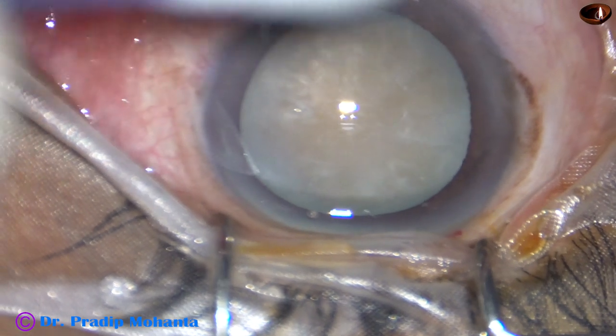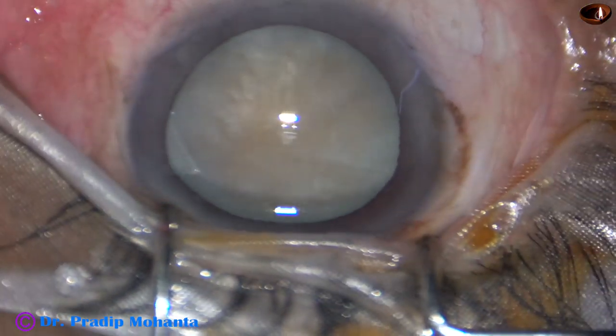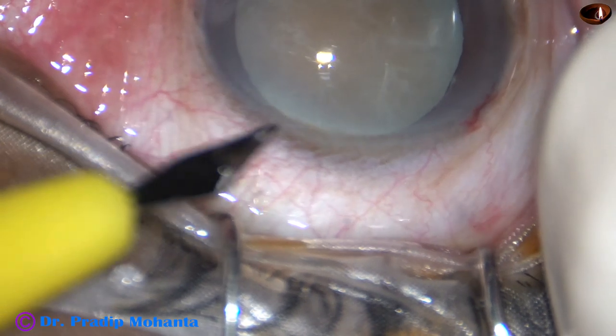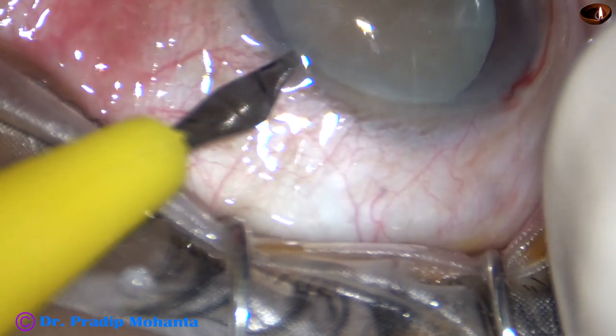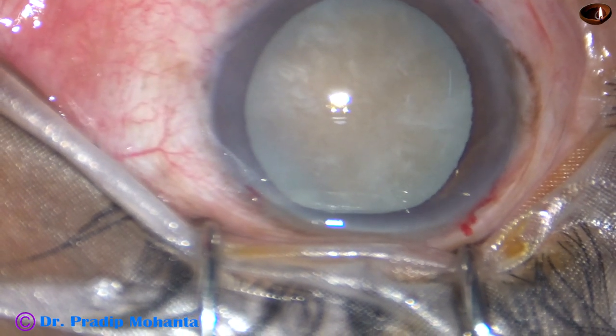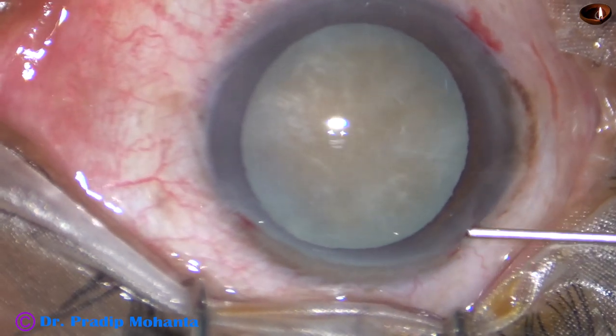An iris spatula has been curved in such a way that its contour conforms to the contour of the posterior capsule, and it can protect the capsule very well. It is about 1 mm in width.